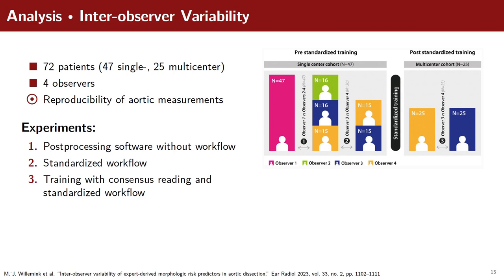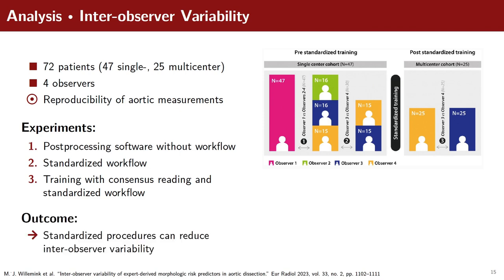The first experiment consists of using post-processing software without a dedicated workflow. The second experiment uses a standardized workflow. Before conducting the third experiment, observers were trained with consensus reading and a standardized workflow. The outcome showed that using a standardized workflow reduces the inter-observer variability of aortic measurements.